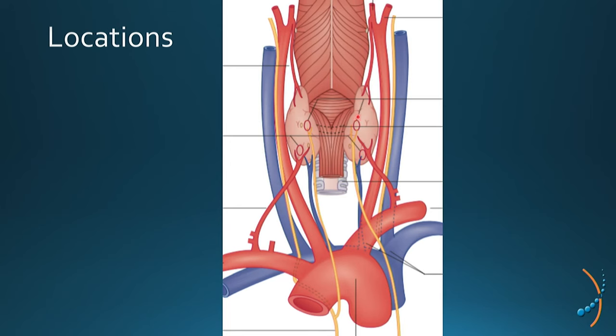But in this location, the realization of maneuvers helps the visualization of the adenomas and can be performed by moving the trachea towards the sides to see the protrusions of some suspicious images in this area.